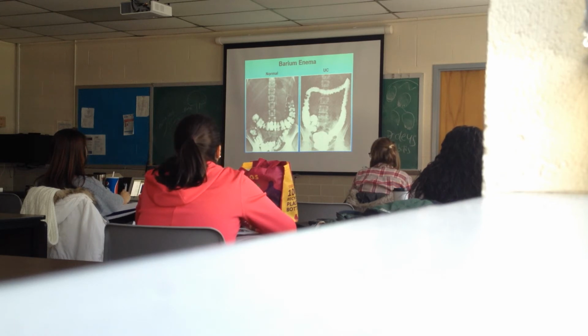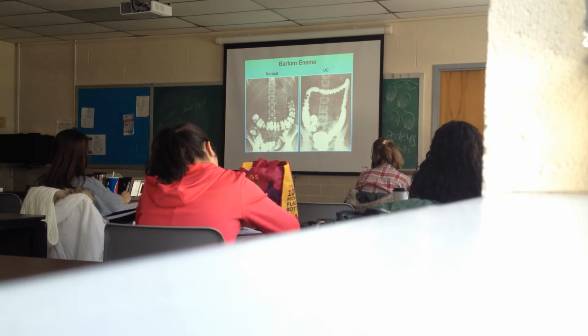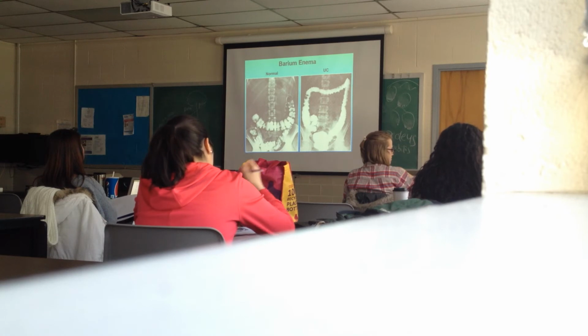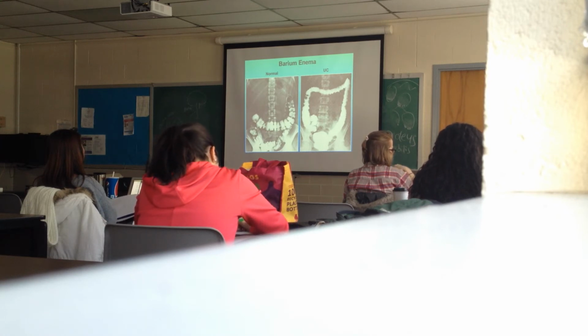The caliber of the bowel looks strictured. That's because it's scarred down. All the slack is taken out of the bowel for the same reason. Bowel strictures, all because of scarring and contracting of the scar tissue. We see irregularities in the luminal topography here. We've got a filling defect here, a little wedge-shaped opacification here, another filling defect there, a wedge-shaped opacification there. Those little filling defects are pseudopolyps.